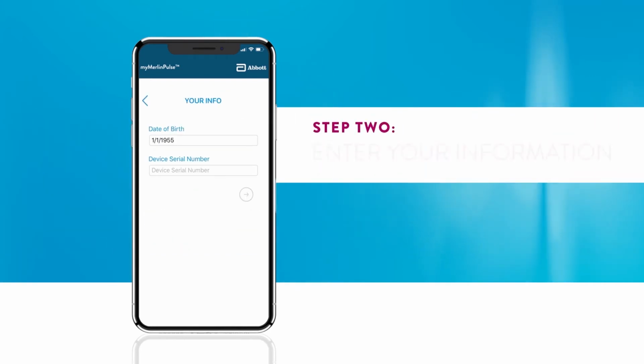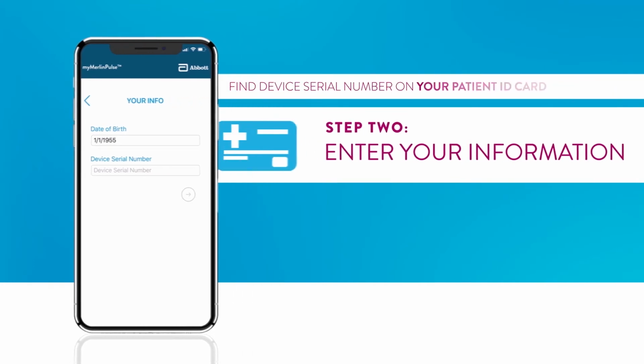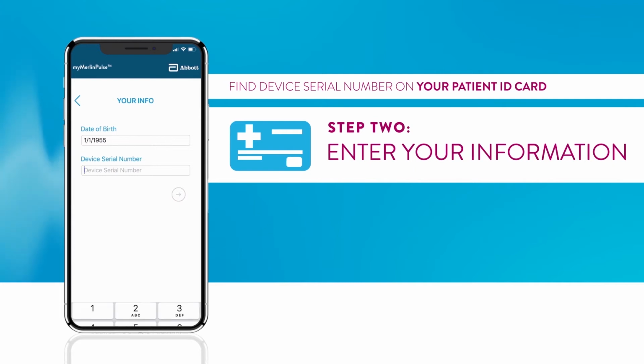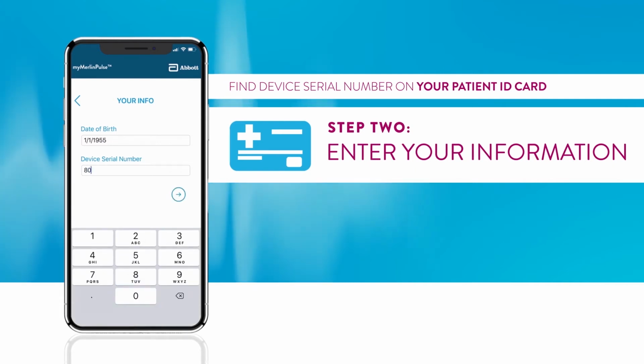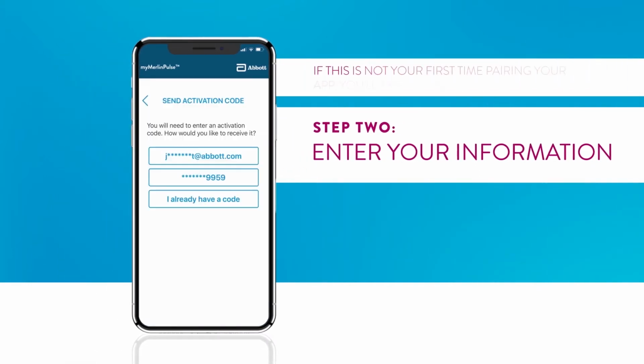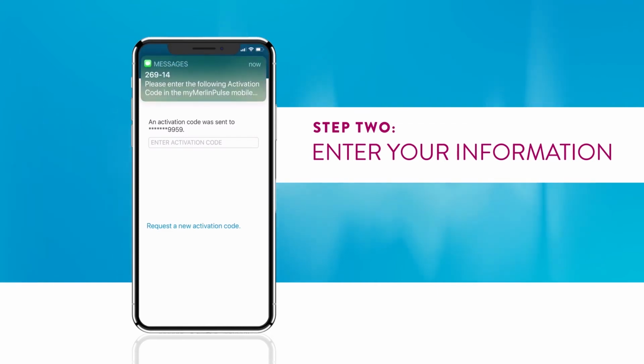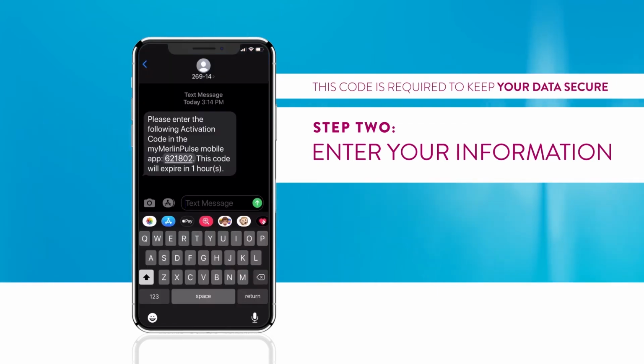Step 2. You'll be asked to enter your date of birth and your device serial number. You can find your Abbott device serial number on your patient ID card. After you enter your information, click the arrow to continue. If this is not your first time pairing the app, you will need an activation code. You can select to receive the activation code via email or text. This code is required to keep your data secure.